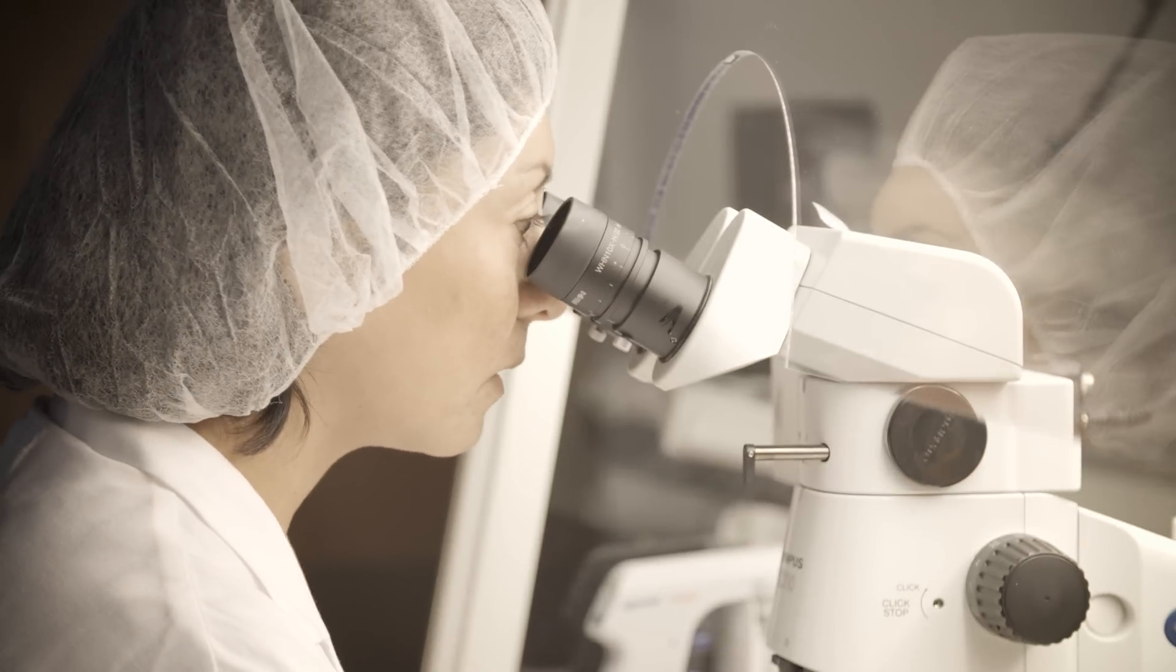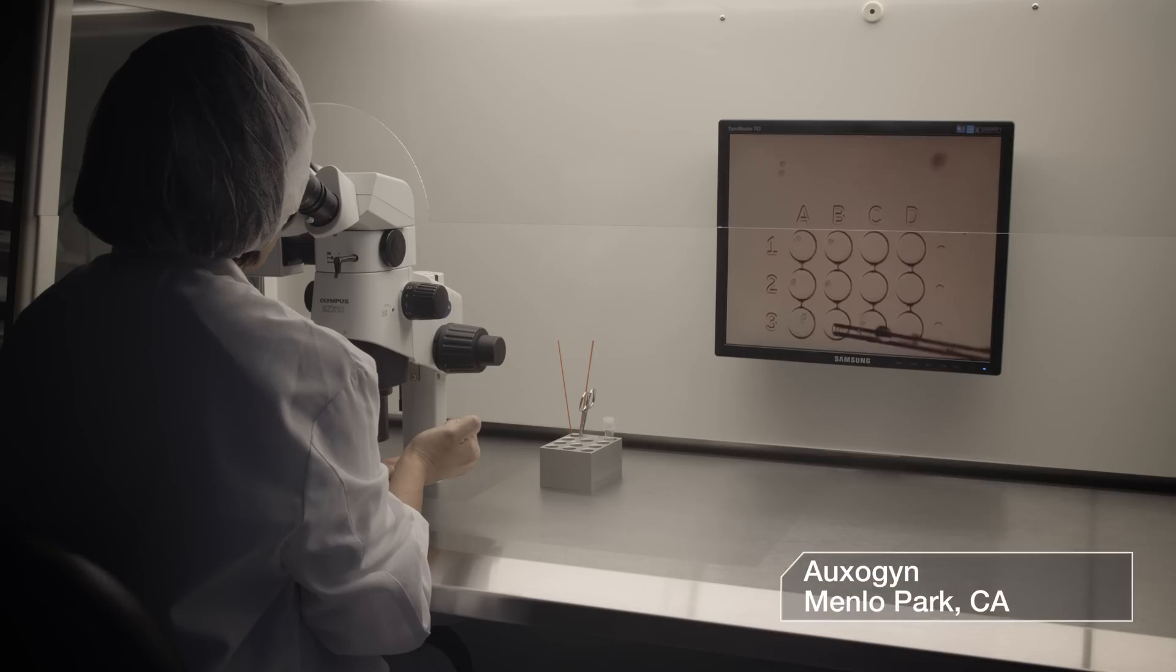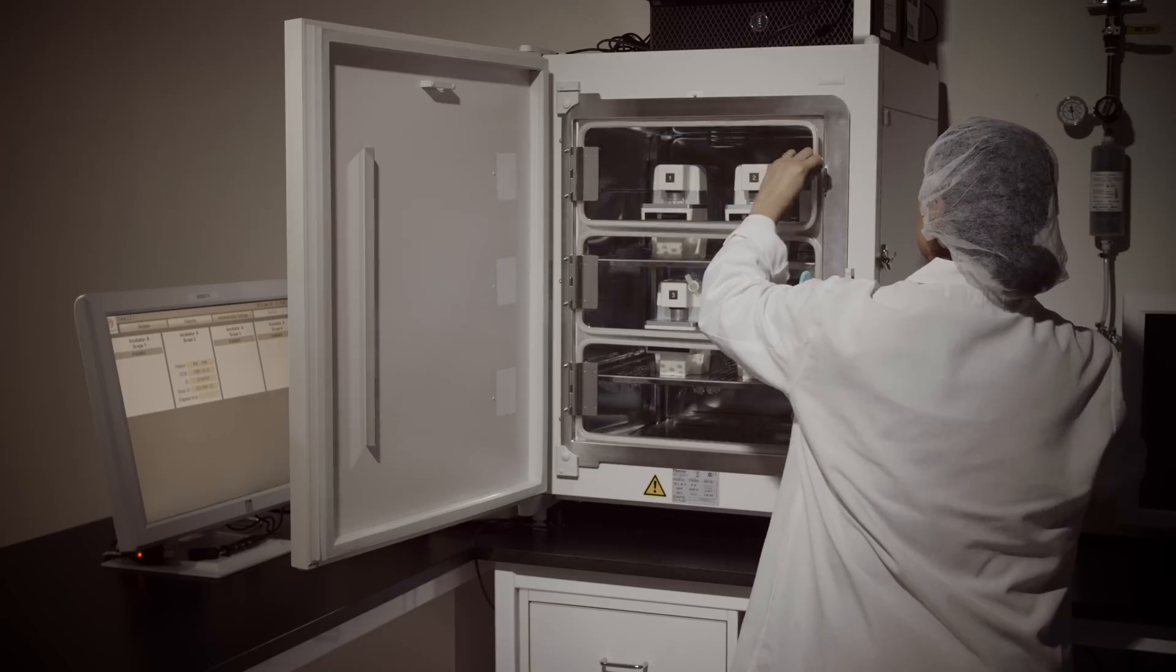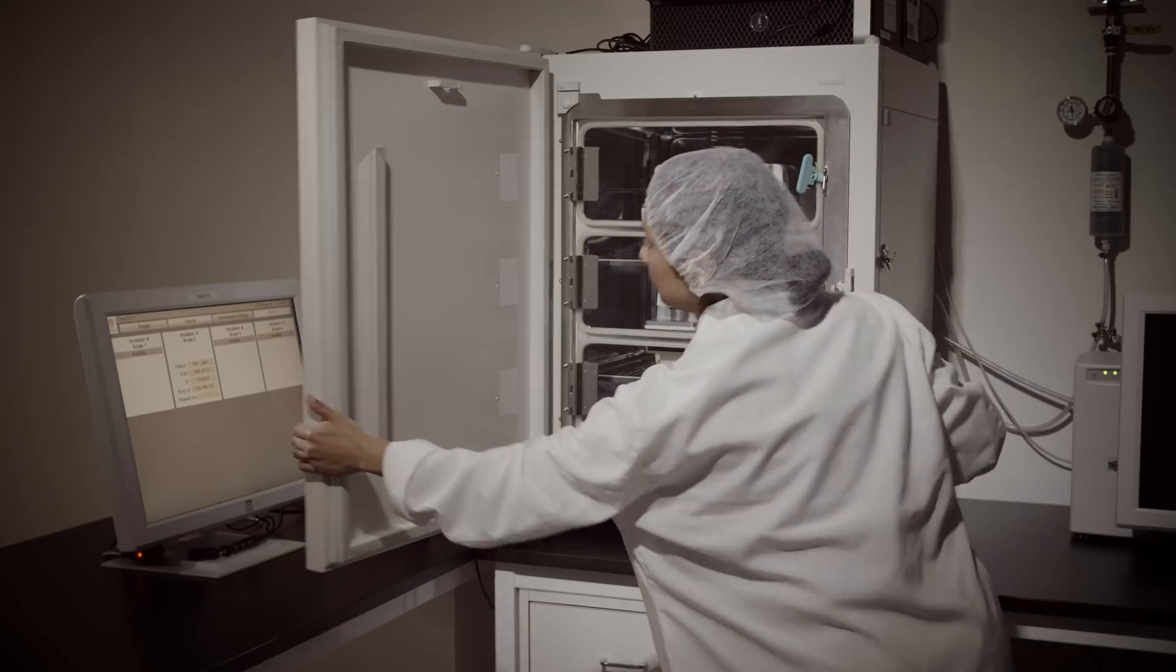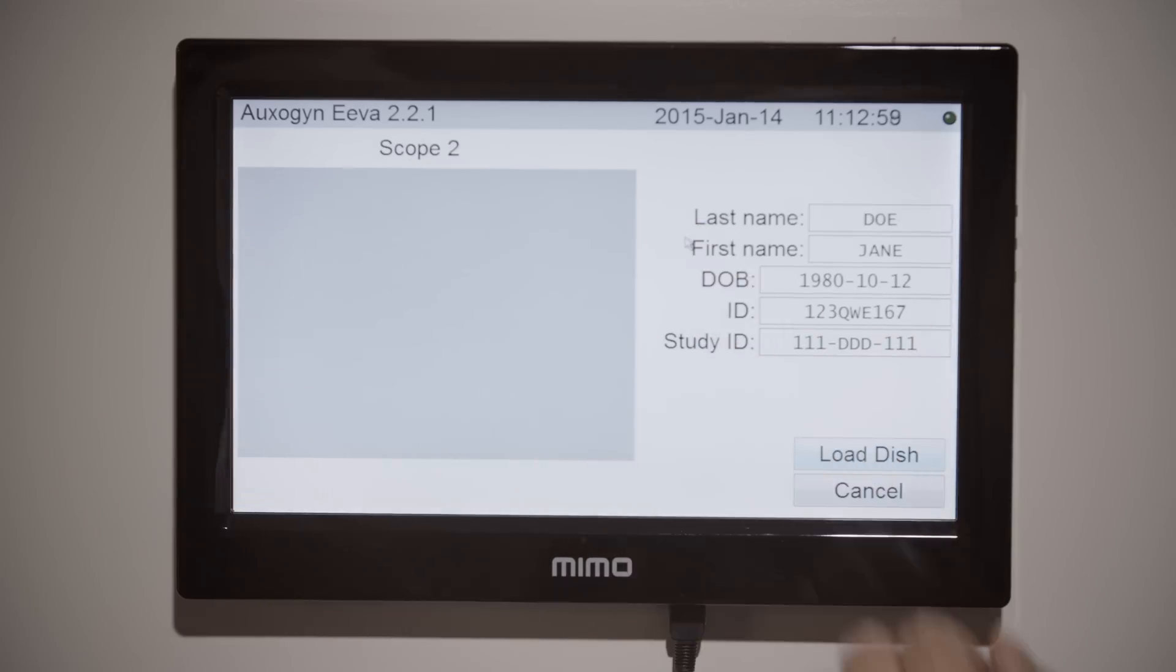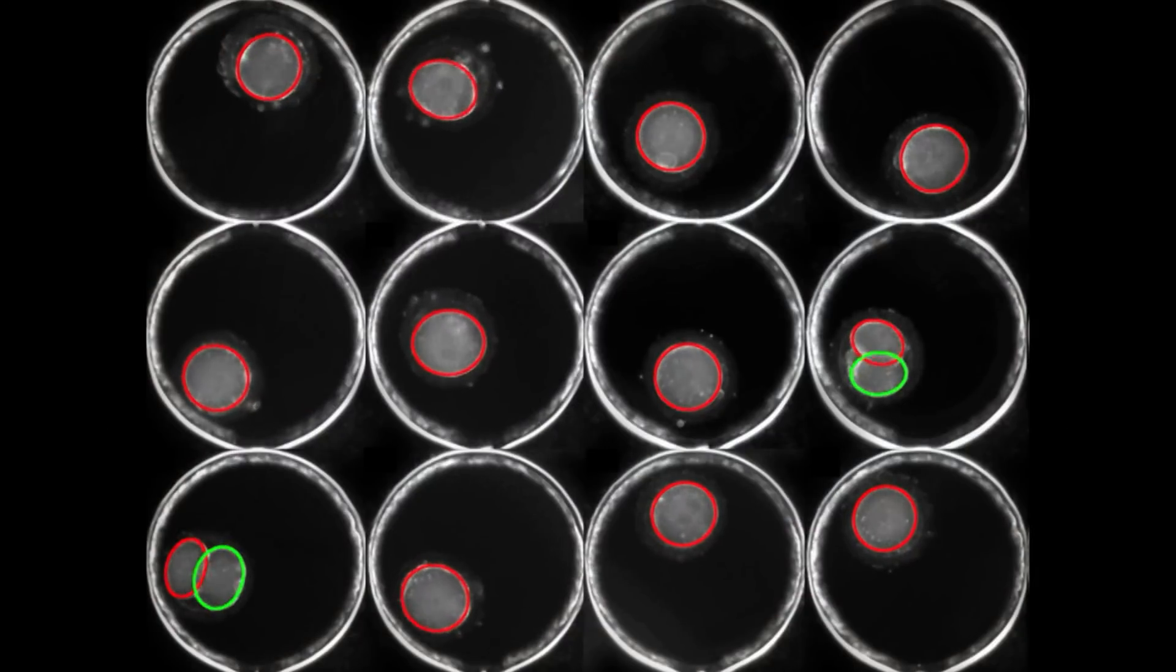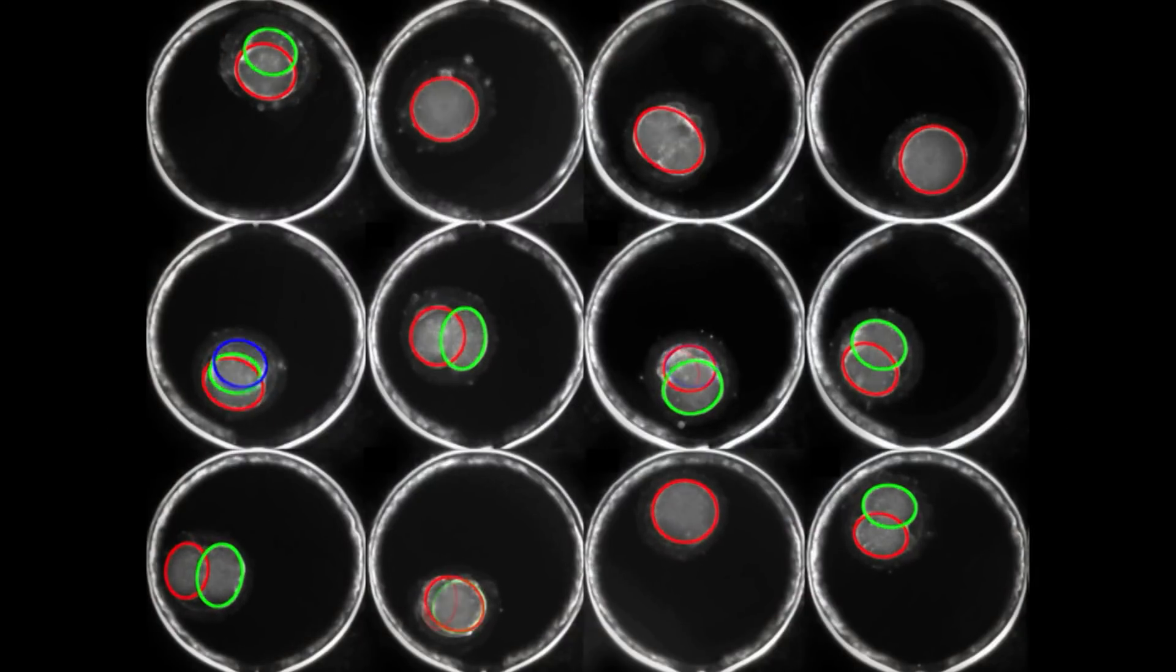A company in Menlo Park wants to make that possible. They film the embryos with a tiny camera inside the incubator. A computer algorithm automatically tracks the development of each embryo. A new ring means the computer has picked up on a new cell division.